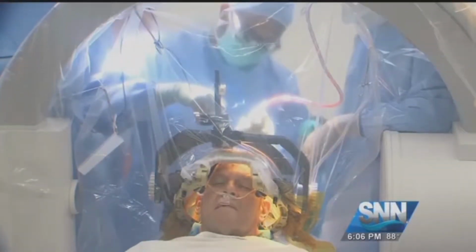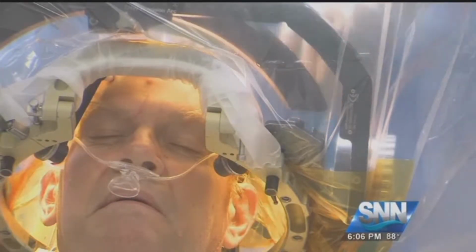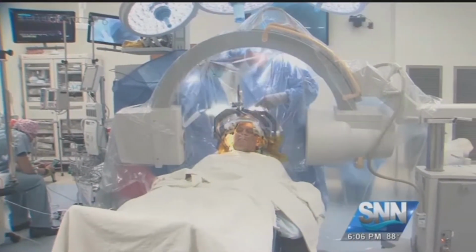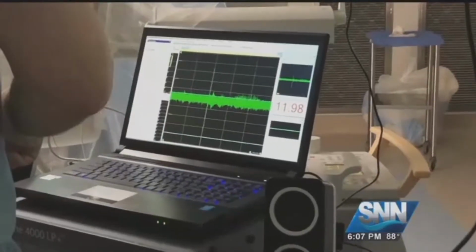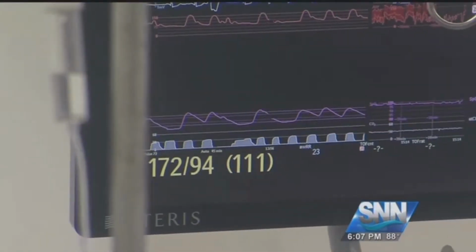In this operation, Dr. Foote is putting the wire in the faulty part of PJ's brain, but it's not plugged in yet. We'll attach it to the skull, and it will be coiled up under his scalp until his next surgery, where Dr. Foote will connect the wire to a generator that, when activated, delivers signals to relax PJ's dyskinesia. You just turn it up, you turn it down, you adjust it. Ultimately, you'll find whatever is the best settings, and then you just leave it there. Swelling caused by the surgery helps. That swollen part of the brain stops functioning for a while. It's stunned. Since that's the part of the brain that's sending out the bad signal, it's actually therapeutic. But first, he has to get through the surgery awake.